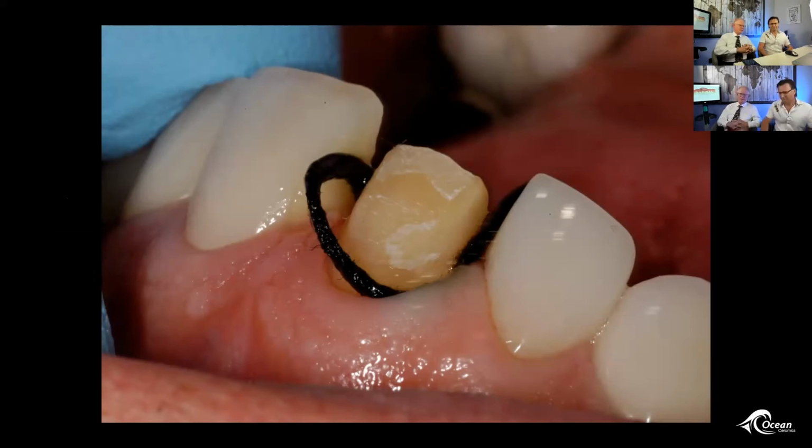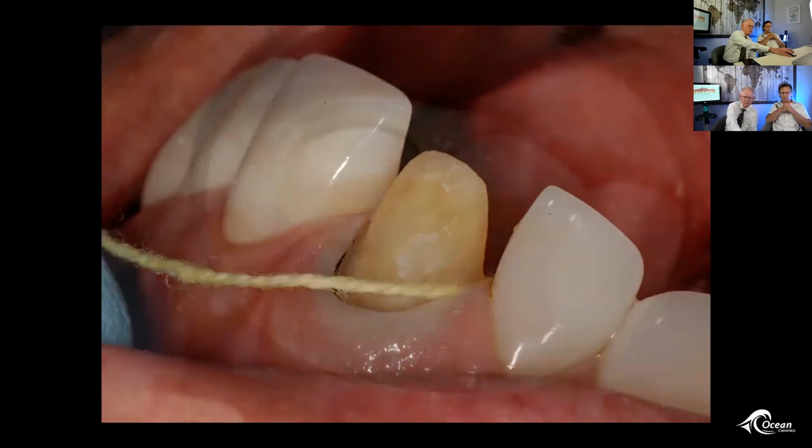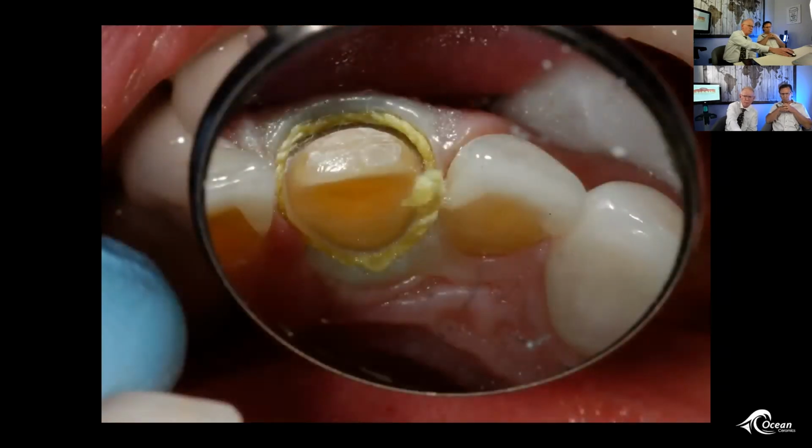Well, this is kind of taking us back away from the digitization and the increase in technical stuff, because Marcy and I actually learned this in dental school. You prep, you get an idea of what you want, you check some of the clearances, and then you pack a cord. You prep down to where that cord stops, and then you pack a second cord. And just to bring that case home, this is actually the first cord. And then we look down it to make sure that we've prepped appropriately.